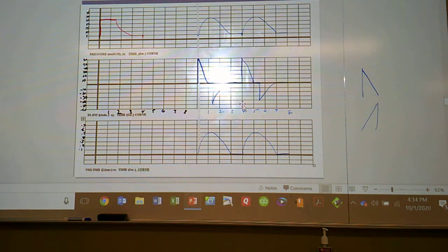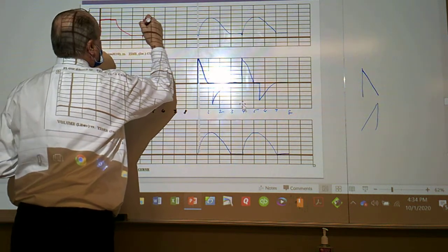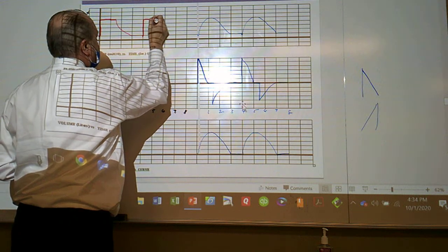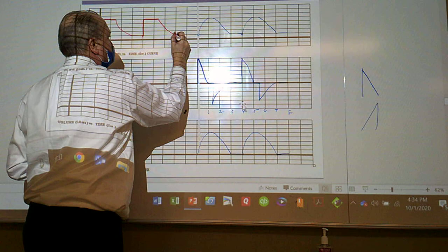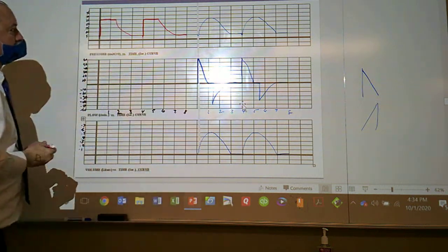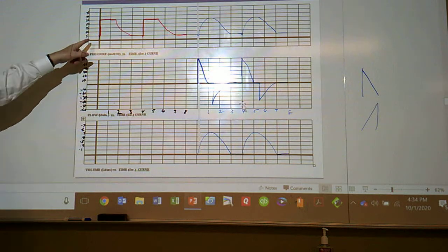How do you want to drop down to like that 1%? Whatever you want to, and then you just drop. But the flow and the volume will have to match up with that. We did that little notch because I got a trigger. Patient trigger, patient trigger.